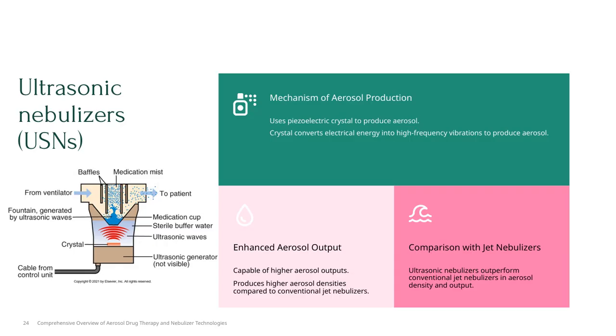Let's take a closer look at how aerosols are produced in these devices. The key component here is the piezoelectric crystal. This crystal has the remarkable ability to convert electrical energy into high-frequency vibrations. These vibrations then generate the aerosol particles that we rely on for effective drug delivery.